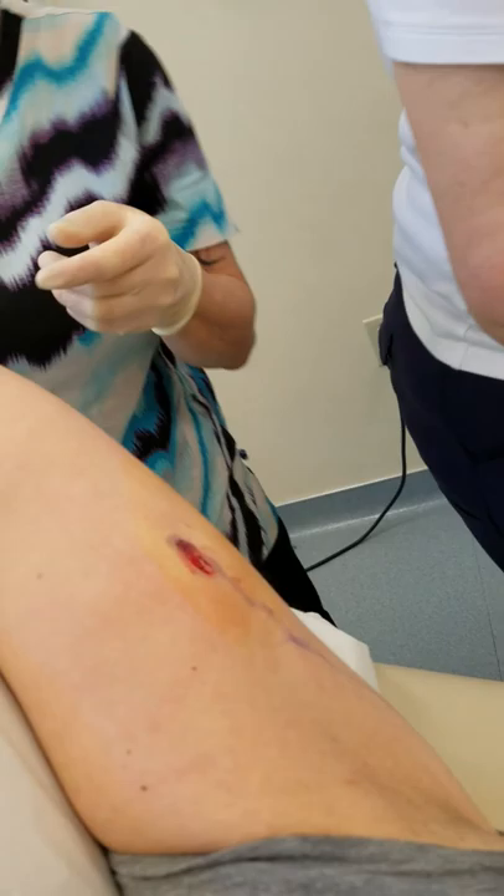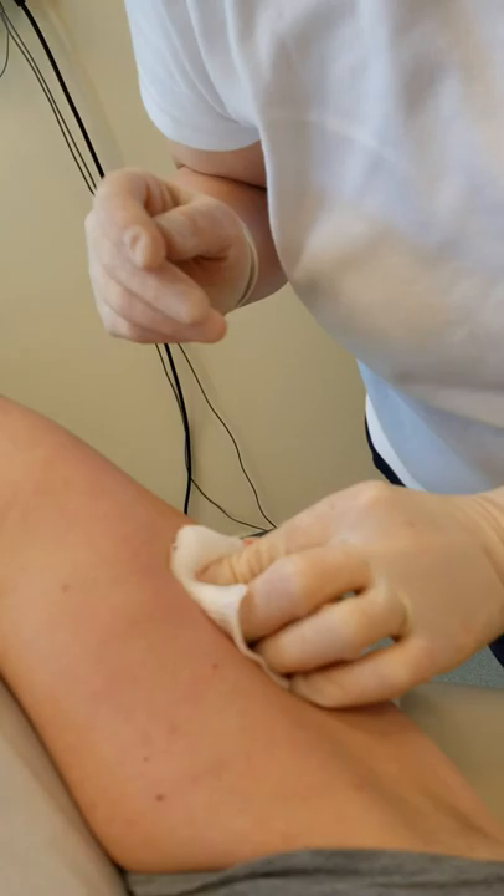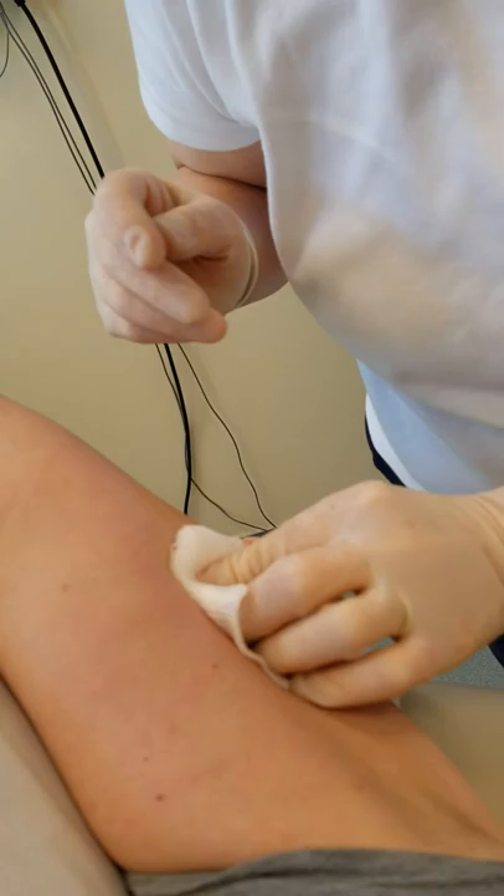We're left with just a minimal opening, as you can see — very little if any bleeding. We can close that up with a Steri-Strip. I call this the Ludwig technique, just because I've never had a technique named after me. It's much easier on the patient than all the digging around and incising that we usually do. Pretty superficial wound here, and we're all done.